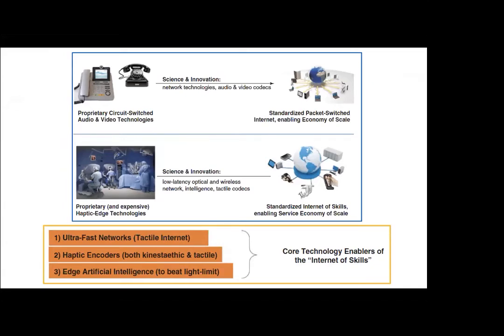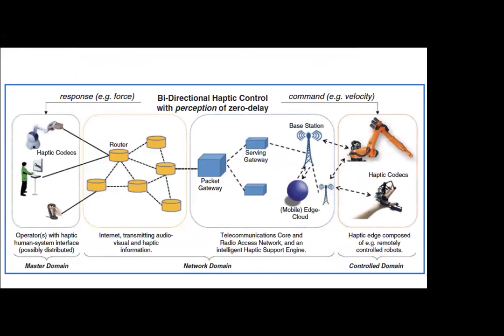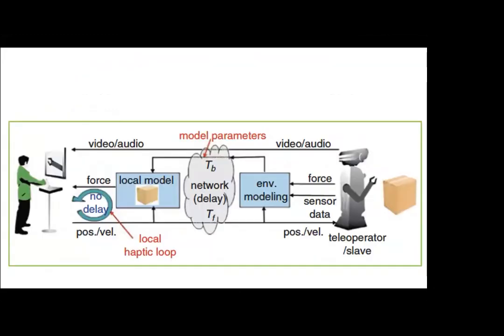it's going to be available to 5G, and haptic encoders are necessary. Then we can do robotic surgery while sitting in our home, and we can do surgery in New York or in another part of the world, which needs connection between the systems, fast internet. 5G will be doing that, and we have haptic encoders, and I'm sure that we will be encoding the haptic codecs, and it's going to be possible to operate even on a patient on the moon as well.